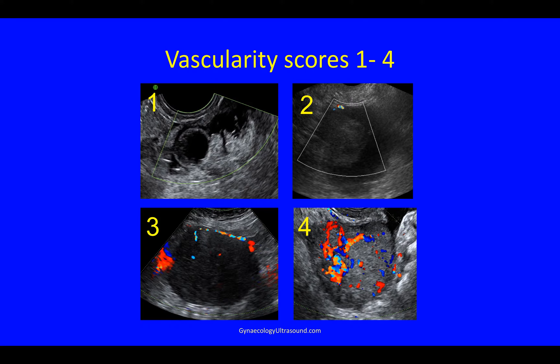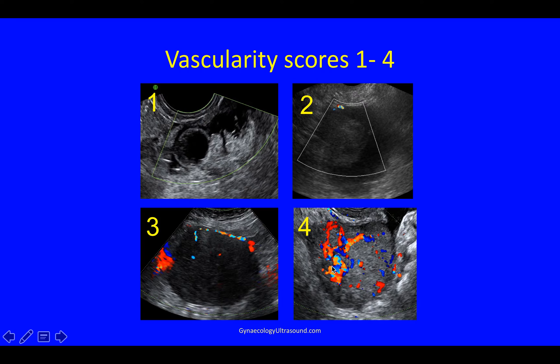Here are some images illustrating that. In this area there was no colour at all on a PRF of 0.3, so that's a score of one. Here you can just see a tiny little bit of flow in the periphery of this cyst — that's a score of two. This colour was just there when I turned it on, so that's three. And here you can see some very strong colour in one area — that's a four. And if you're not sure whether something is one, two, three, or four, you always go for the worst one. It's one and four that are the most important, as you'll see in a moment.